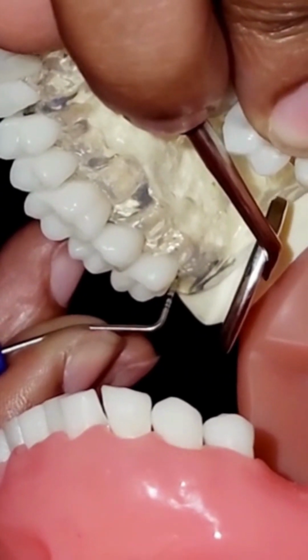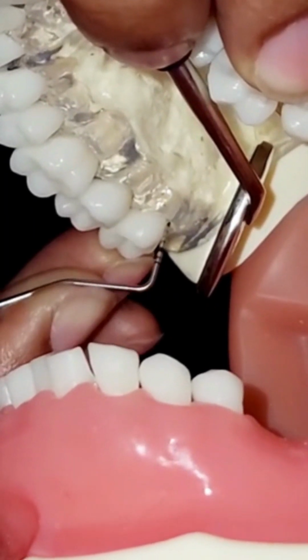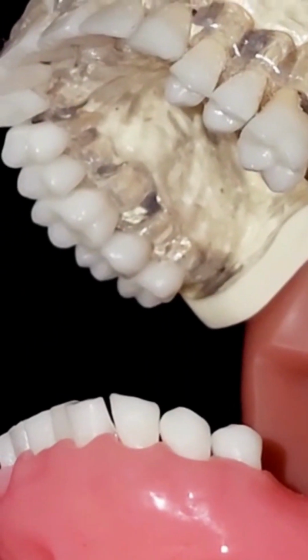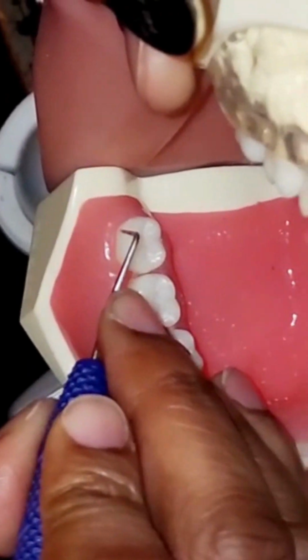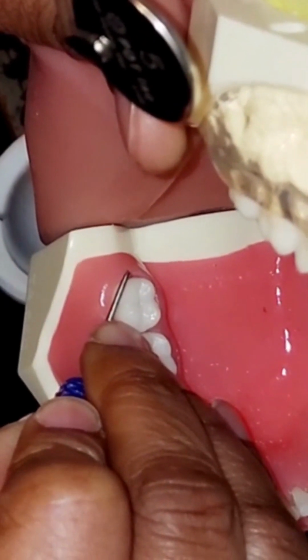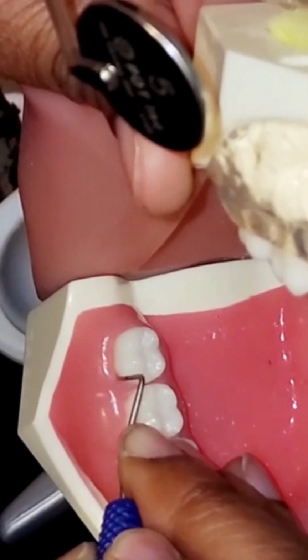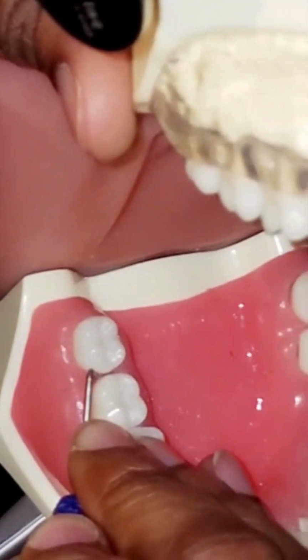That is a 4. 6. 7. On to the mandible. Number 32. Buccal. We have 12. Staying at a 6. 5.